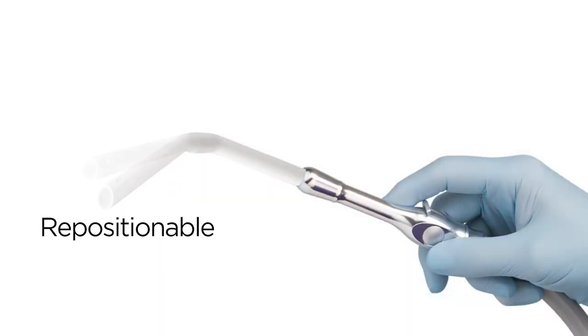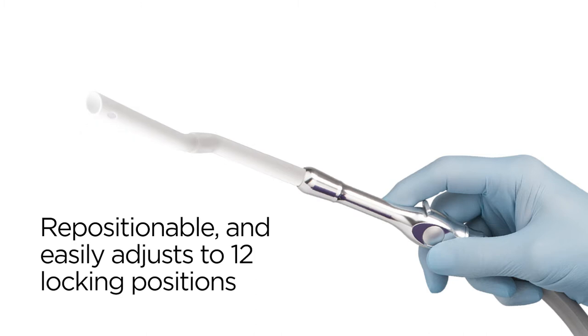Hi, David from Practicon here to tell you about the truly original Angolese adjustable HPE tips. Its repositionable yet rigid design lets you easily adjust Angolese to 12 locking positions to meet every treatment and operator requirement.